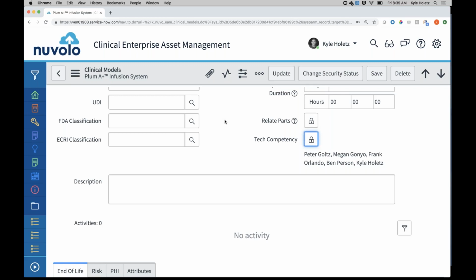One of the questions I'd ask there too is, how do you guys track it when you do a repair, close it, but you know it's not necessarily 100% correct? Are you tracking that in any way? Is there any sort of sub-state or anything like that? Just closed out, and then you have an idea if something comes in like a day later. Yeah, if you start seeing repeat events, then you know that some technician needs training on something. Got it. Or it's an old device, with repair versus replace too, right?